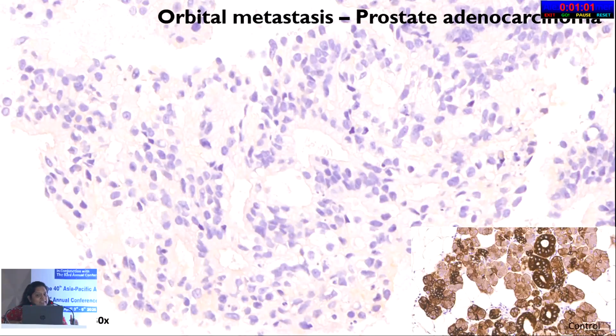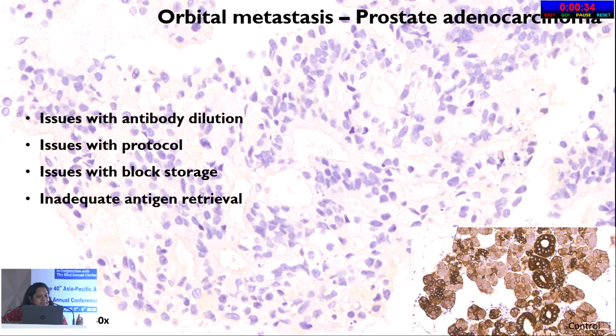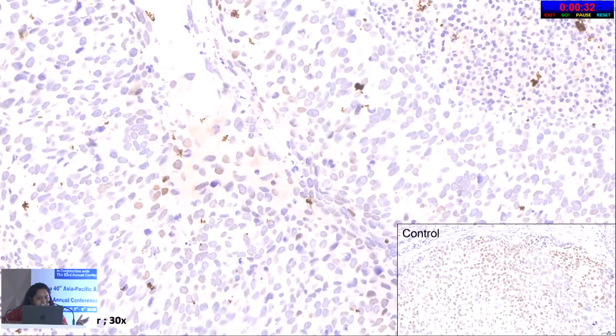And the second thing, this was a case of prostatic adenocarcinoma, metastatic to orbit, and this is a pancytokeratin. Usually you expect this to be very highly positive, but what you see here is just a minimal, faint stain of cytokeratin. Why did this happen? Because of the antibody dilution, probably an issue with the protocol, or the block storage was not good, and there was inadequate antigen retrieval.